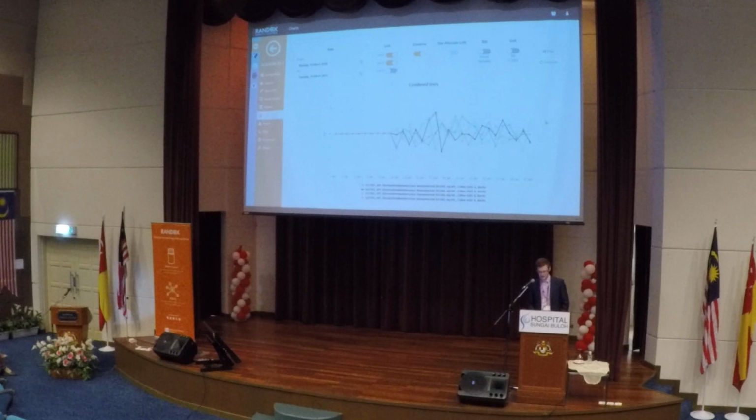So if we scroll down a little bit, we can see that we have all of these different colored bars, and these colored bars represent a different test run on a different instrument. So we can see here we have 1573 EC, and we have 1621 EC. Those are our lot numbers on instrument A from Lab 1, and the same lot numbers from Lab 2 on the instrument B. So say for instance we want to just compare lot 1573, so we can just left click and turn off the other 2 lots so that we can see these a little bit more clearly.